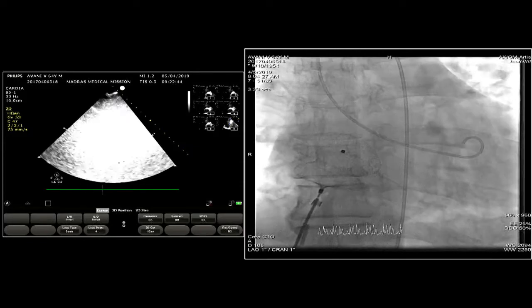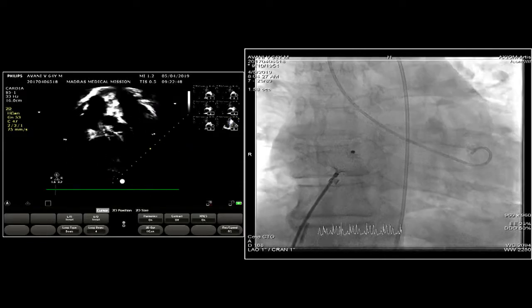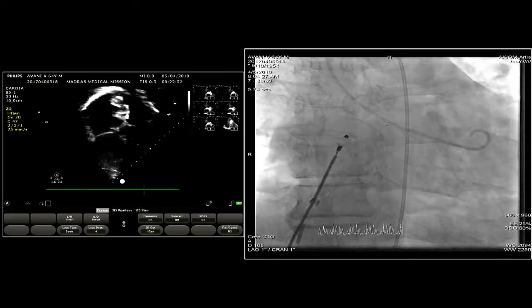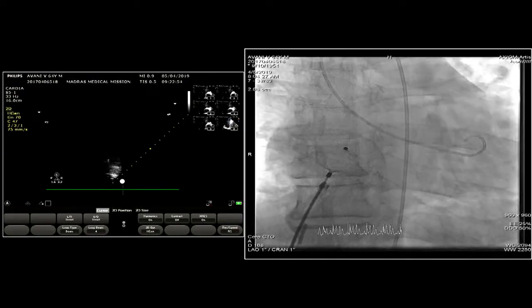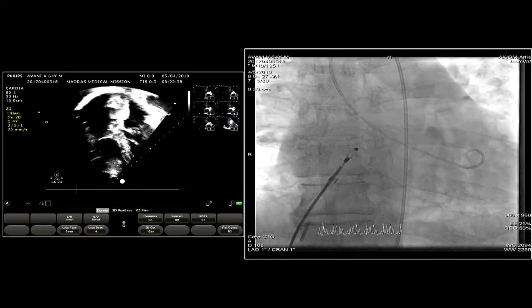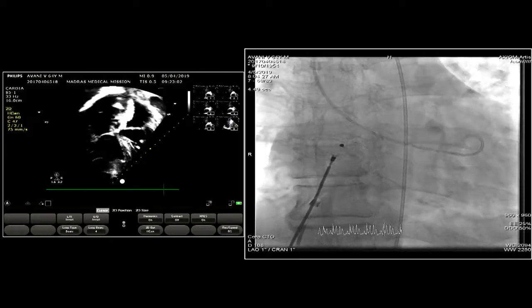So 40 milligram furosemide given? Okay. Give also a touch of fentanyl to him. He's probably anxious. A tiny dose of fentanyl. So now we are showing a thoracic echocardiography, even though it is marginally suboptimal. Still, Srija is managing good quality images.